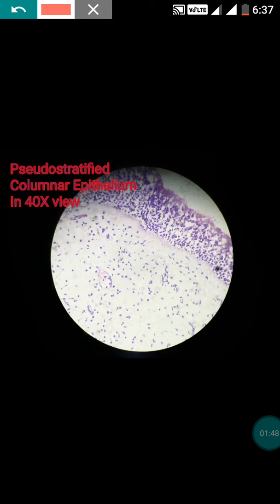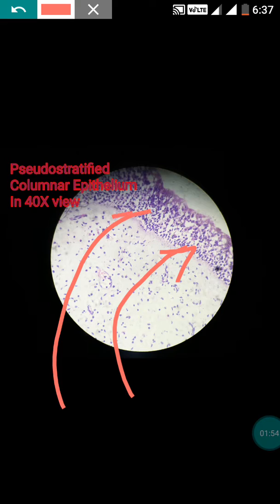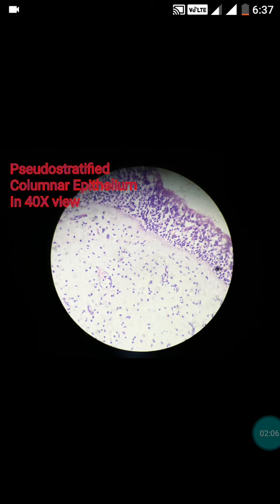In the high power view, look at the cells — the nuclei in the cells are arranged at different levels, which is why it looks like a multi-layered epithelium. However, it is actually a single-layered epithelium. Such epithelium is called pseudo-stratified columnar epithelium, and this type is present in the nasal mucosa.